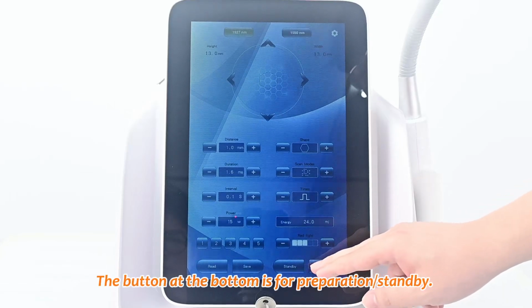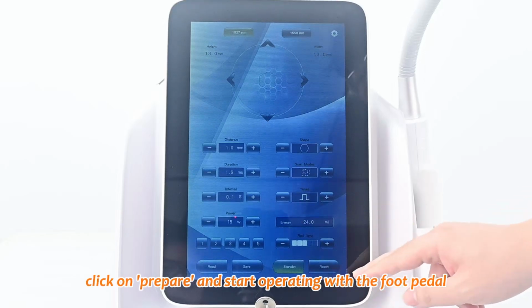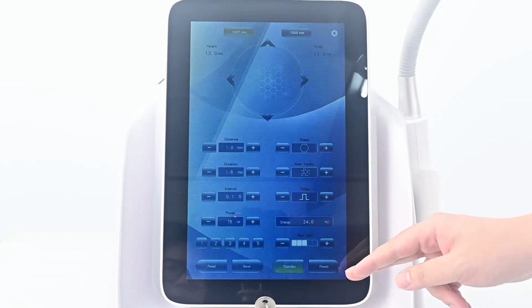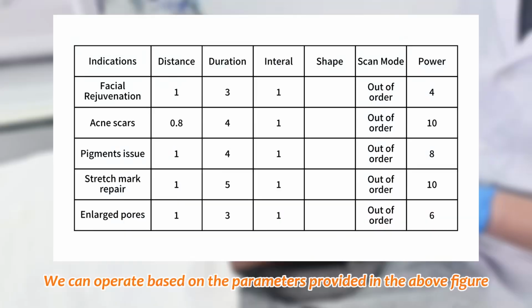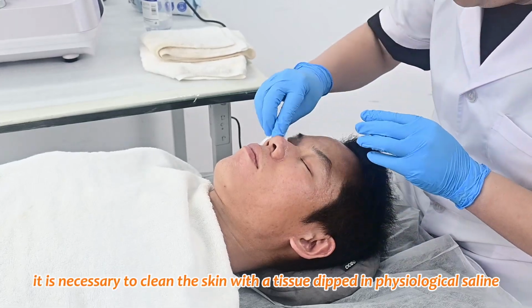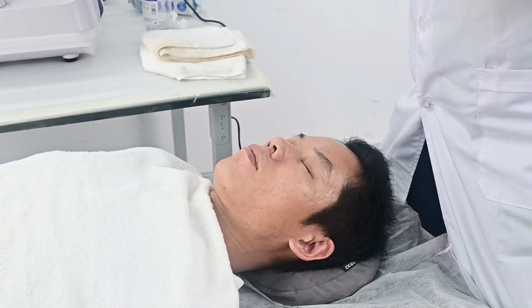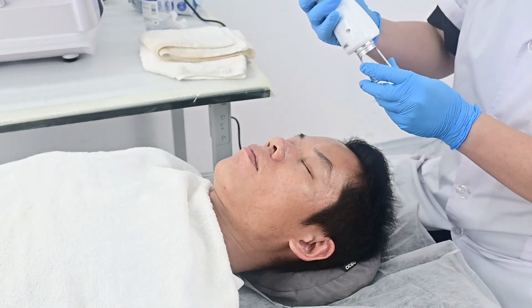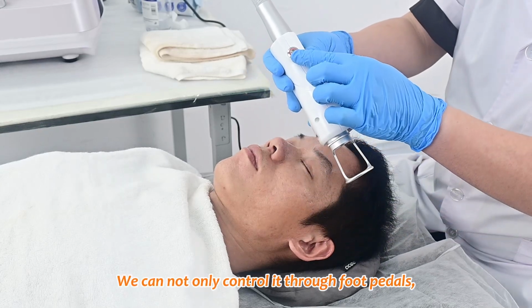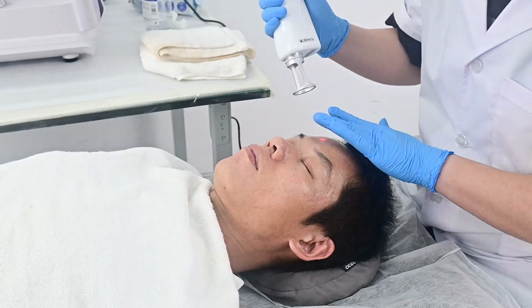The button at the bottom is for preparation standby. After adjusting the parameters, click on Prepare and start operating with the foot pedal. We can operate based on the parameters provided in the above figure. Before operation, it is necessary to clean the skin with a tissue dipped in physiological saline. We can control it not only through the foot pedal, but also through the joystick buttons.